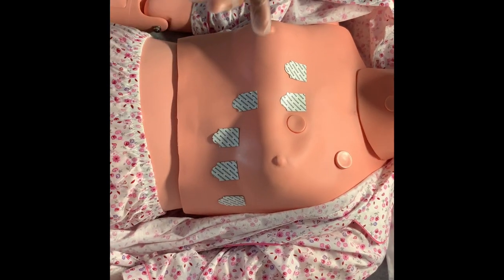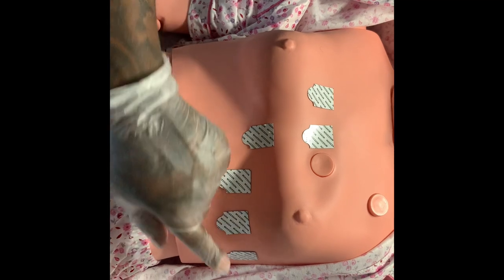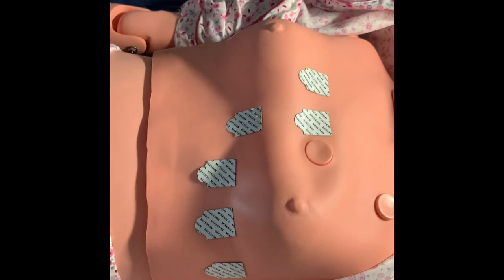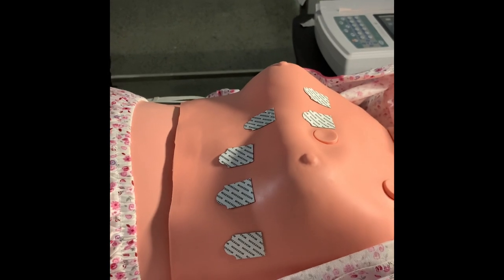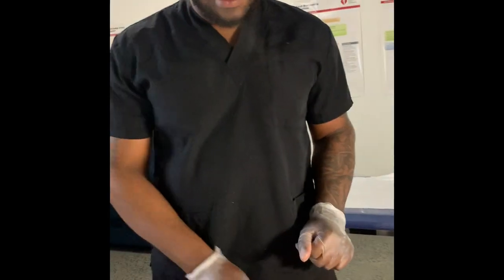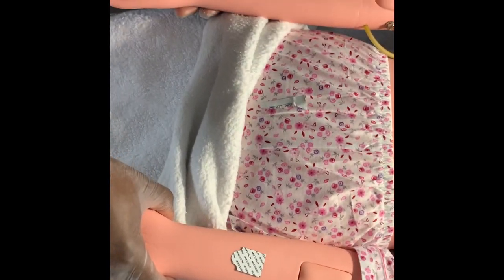This is how you want it to look — everything pretty much leveled out. You have V1, V2, V3, V4, V5, and V6. When you're doing the EKG, you won't have to take off your bra while training here at the emergency training center. At hospitals, of course, your patients might have to remove their bra, but for training, no one takes off their bra. I also have my electrodes on the arms, bilateral on both sides.